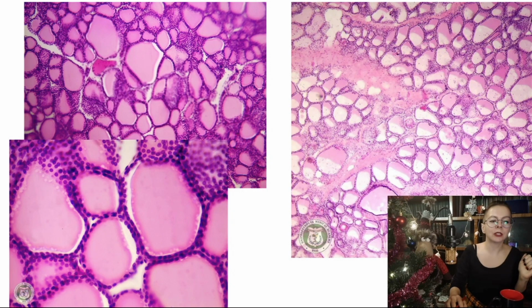And the second criterion is the presence of connective tissue in mammary gland. In the thyroid, it's not very prominent. So first of all, look, this horizontal line is very, very helpful. Sometimes it is not very prominent. You have to be very attentive to distinguish it, but it works.